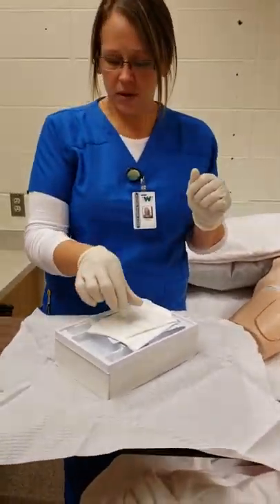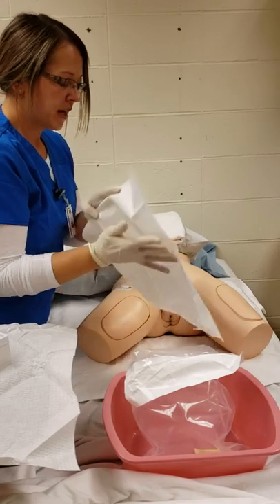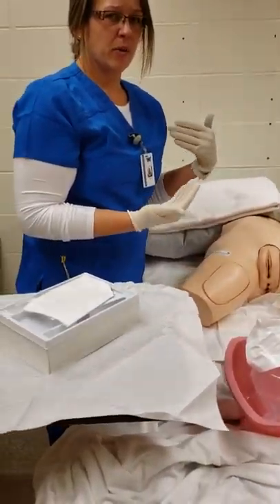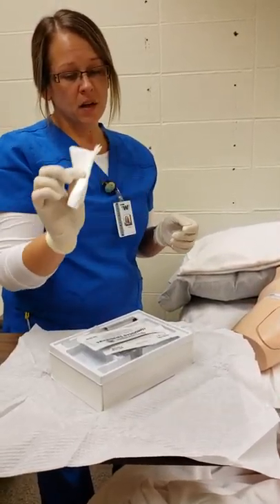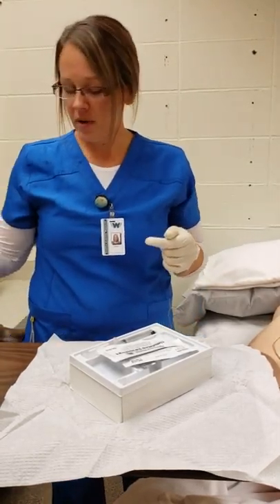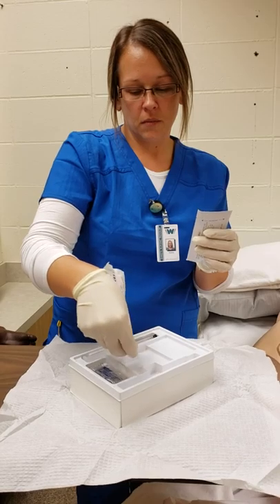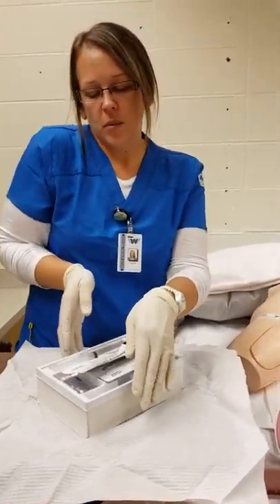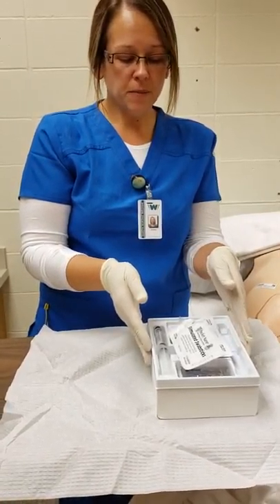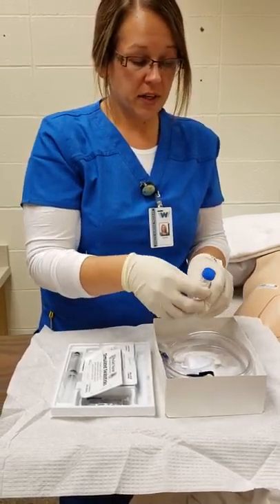I grab my drape and place it under my patient — shiny side down to protect the bed from any fluid. I would also have placed a chucks pad under there beforehand. I have a fenestrated drape which I won't be using for the purpose of this video, so it goes to garbage. I have swab sticks to clean the area. Moving things within my sterile field, keeping the one-inch margin. I don't need this part so it goes to garbage.